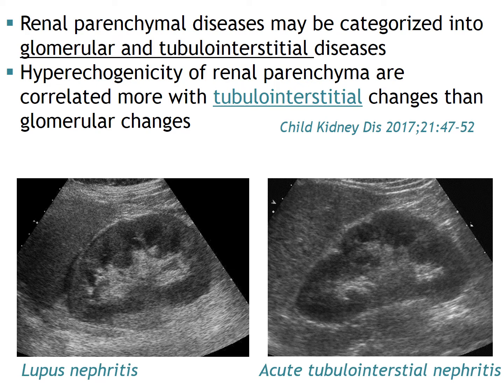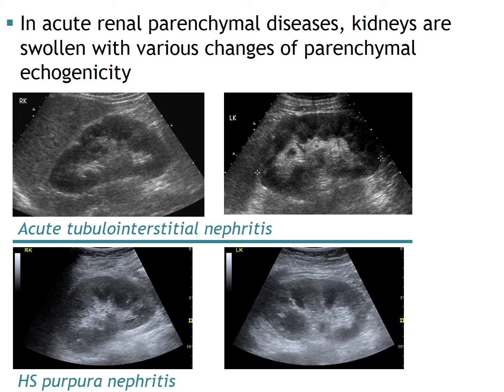Here are two examples of acute renal parenchymal disease. On the left side, lupus nephritis: the kidney is swollen, cortical echo is similar to or slightly lower than liver echo, and there is a small amount of ascites beneath the liver. On the right side, acute tubular interstitial nephritis: the kidney is swollen, cortical echo is lower than liver echo, and corticomedullary differentiation is indistinct. In another case of HS purpura with nephritis, both kidneys are swollen and renal cortical echo is elevated with preserved corticomedullary differentiation. In summary, in acute renal parenchymal disease, kidneys are swollen with various changes of parenchymal echogenicity.